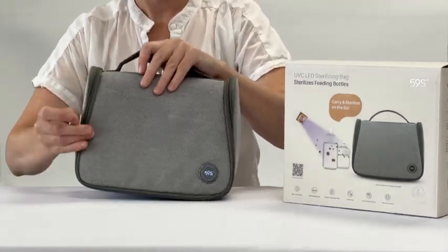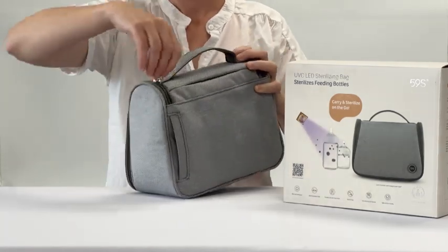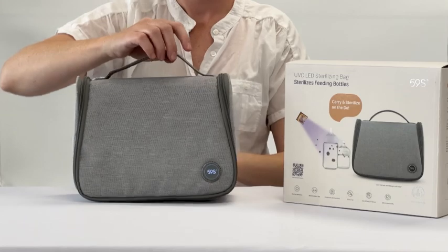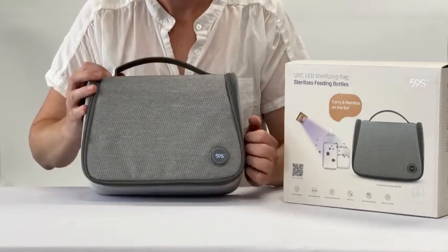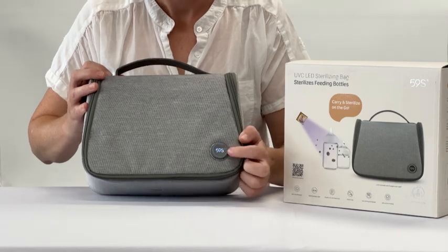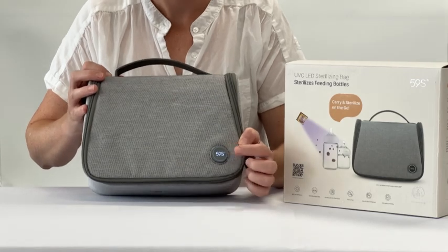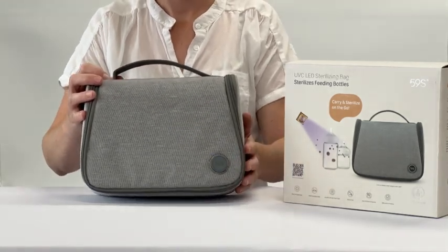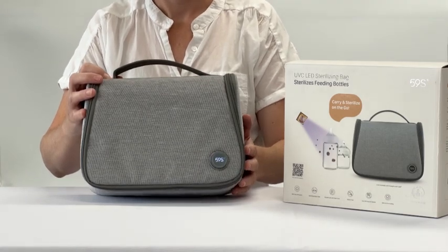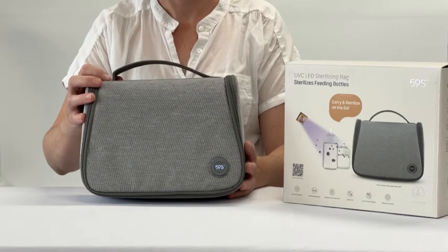Zip the bag up. If the bag is off, tap the button on the front to turn it on where it will illuminate with a solid light, and then when you press it again the flashing light indicates that it is sterilizing. It will take 3 minutes to sterilize the contents of the bag.